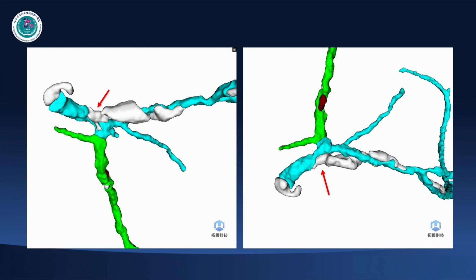Next. We can enlarge the picture and zoom in to more clearly see the distribution of the calcified lesion. This time we delete the brown soft tissue. We can see clearly the calcified lesion at the left main, and a little bit protruding to the ostium of the circ. In the proximal LAD there should be deep calcification, but further distal in the LAD there is a relatively large calcified plaque embracing the proximal LAD. So that place is what we should pay more attention to.